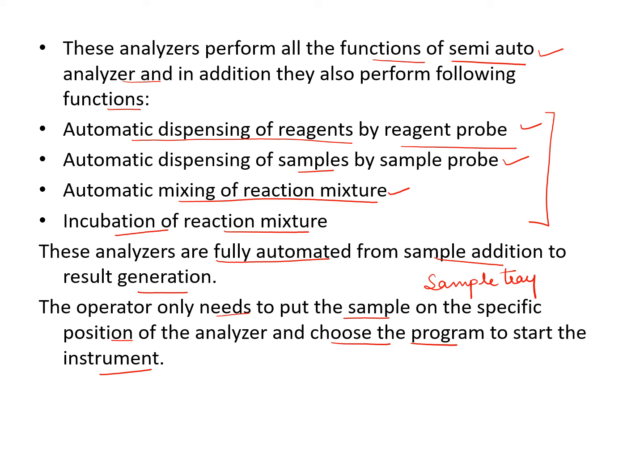In the next lecture, we will see the differences between the semi-auto analyzer and the fully auto analyzer. What are the differences between these two, semi and fully auto analyzer?